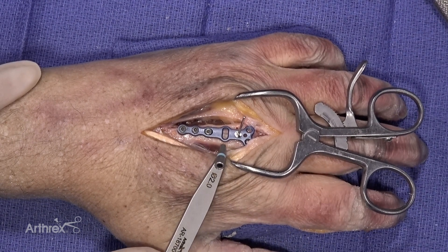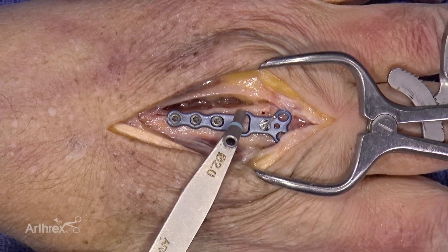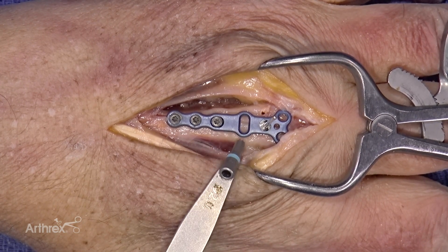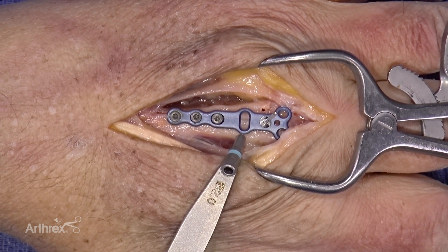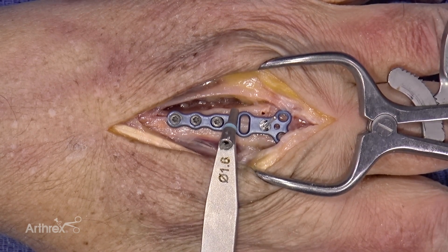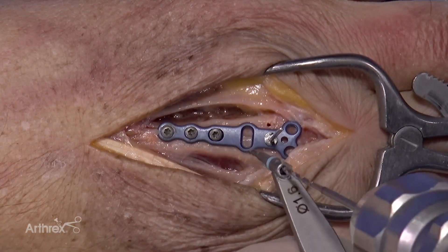A decision must be made by the surgeon as to what direction the rotation needs to be corrected, whether it be in a radial direction or an ulnar direction. Should the surgeon wish to correct rotation into the ulnar direction, the ulnar side of the hole should be used. Should the surgeon choose to correct the rotation into a radial direction, the radial segment of the hole shall be used. For the maximum amount of rotational correction, the screw should be placed at the edges of the oblong hole. I have chosen to rotate this patient in a radial direction, and therefore we will drill into the radial side of the hole.